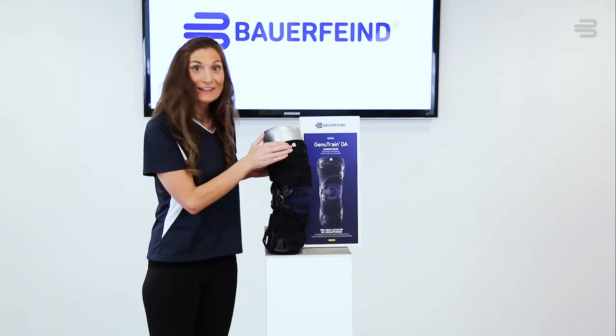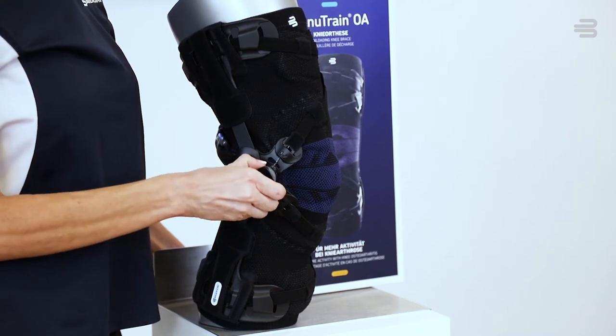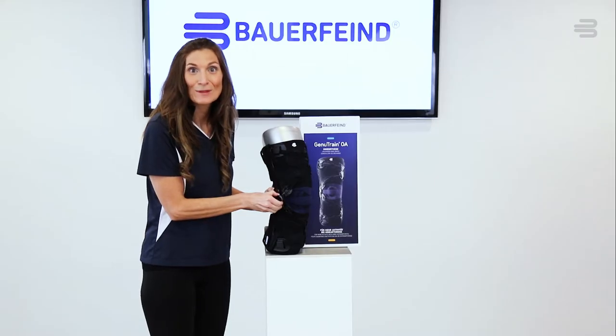Next, locate the BOA dial. To release tension, you are going to pull out the BOA dial. You will hear a click. You can now put the product on.